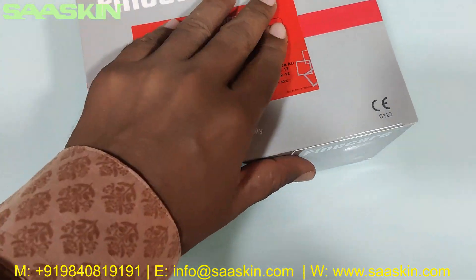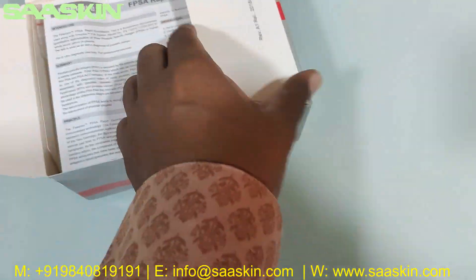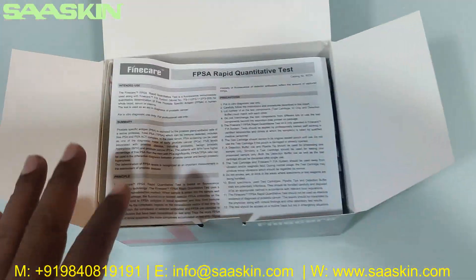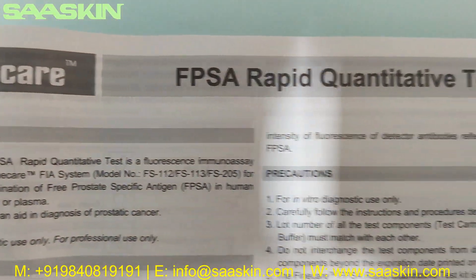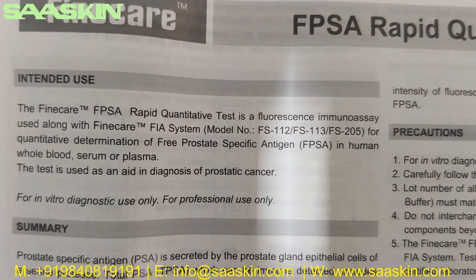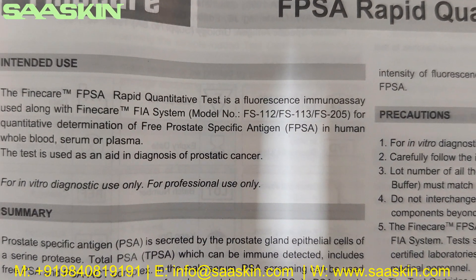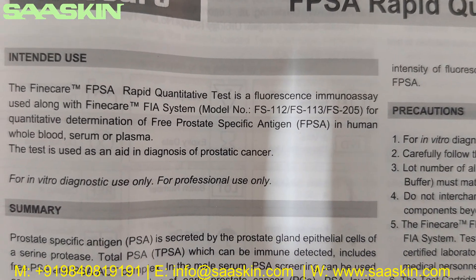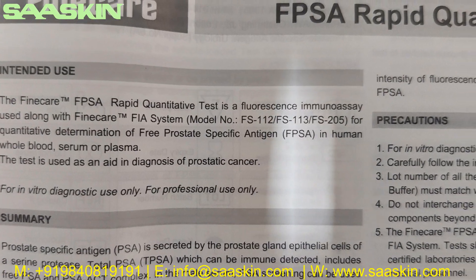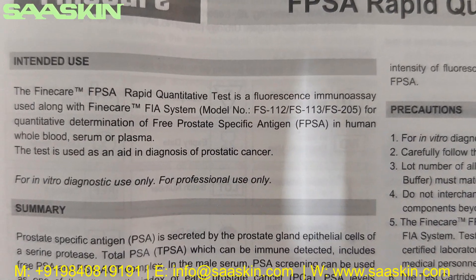Okay, let me unbox this for you. Inside you can see it says FineCare FPSA Rapid Quantitative Test. This is a fluoroimmunoassay used along with the FineCare FIA system modules, for the quantitative determination of Free Prostate Specific Antigen in human whole blood, serum, or plasma.